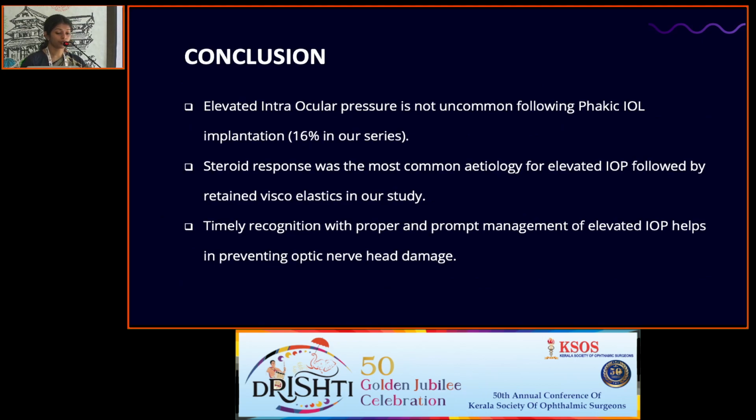So, conclusion, elevated intraocular pressure is not uncommon following phakic IOL implantation, 16% in our series. Steroid response was the most common etiology for elevated IOP, followed by retained viscoelastics in our study. Timely recognition with proper and prompt management of elevated IOP helps in preventing optic nerve damage.